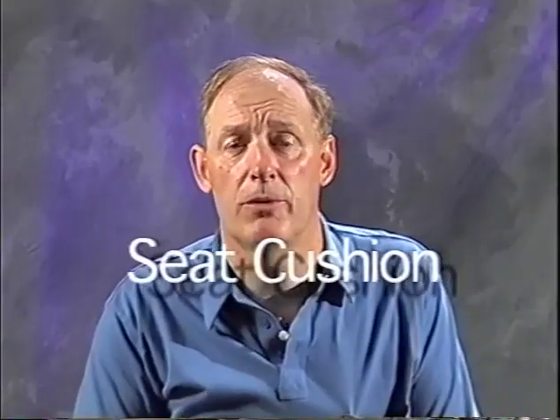Cushions are extremely important, and there are so many choices and seating systems out there that a whole video could be made just on cushions and seating systems. Basically, what I want to emphasize is the importance of having any kind of a good cushion under you. One, to avoid skin breakdown, and two, to avoid your legs from flopping around on the hard seat of a chair. So the cushion does several things. One, it supports your body. Two, it keeps you from getting skin breakdowns.